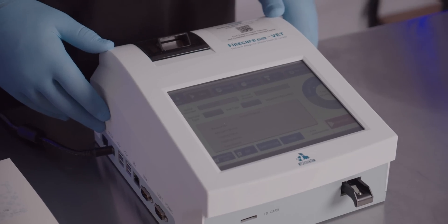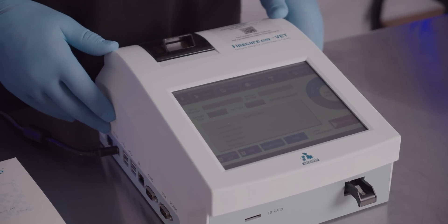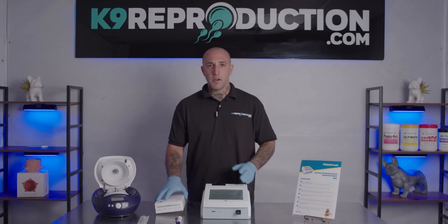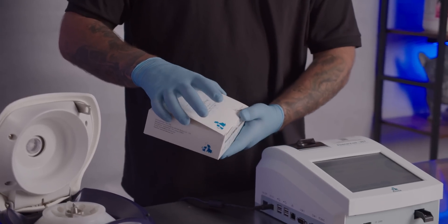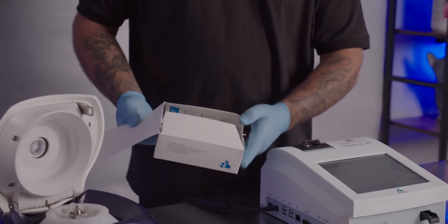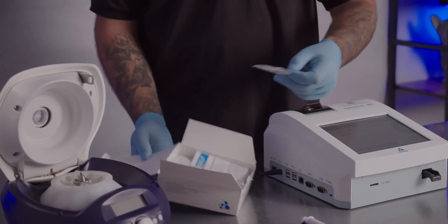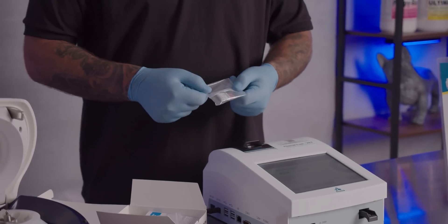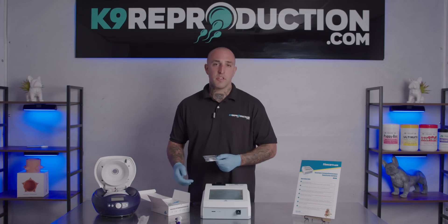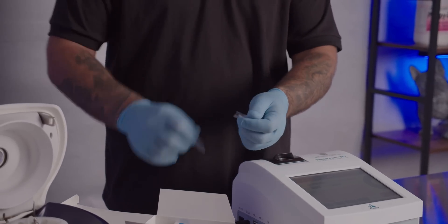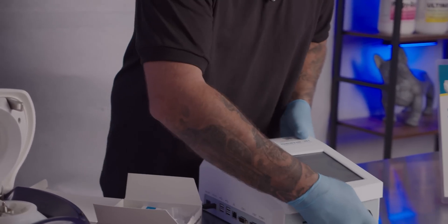Step one, we're going to turn on the machine and allow it to come up to operating temperature. From there we can open up our box of progesterone tests. Inside of the box you're going to find an ID chip. The ID chip has the calibrations built into it. Each box of tests comes with a new ID chip. We're going to open it up and insert it into the front of the machine.